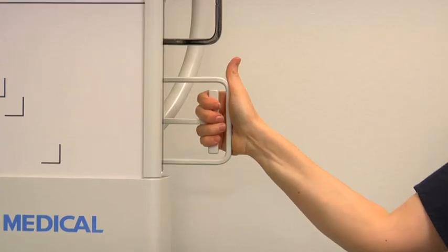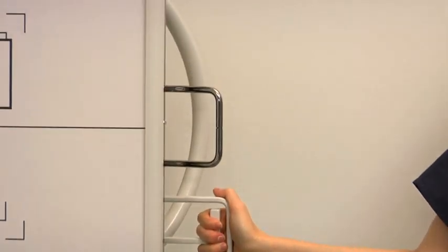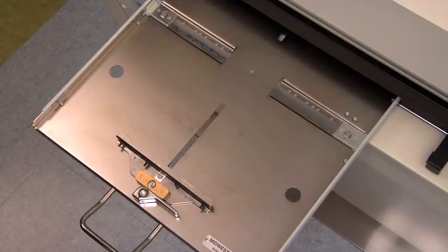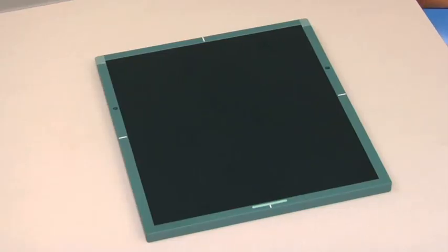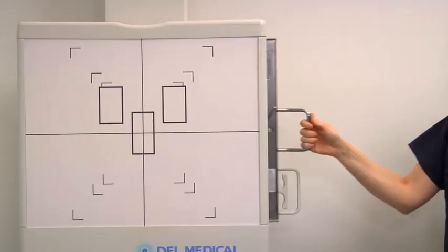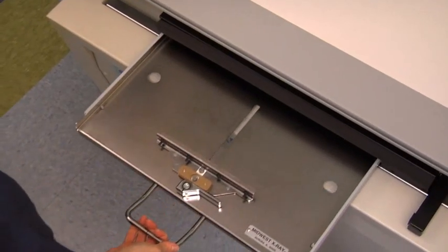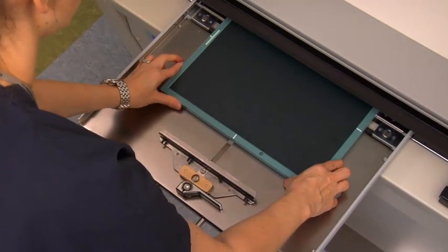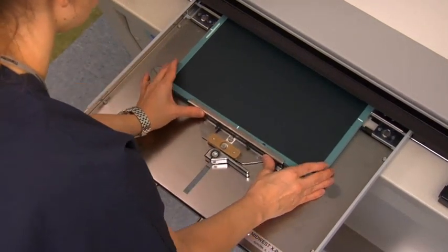The image receptor consists of an upright bucky with automatic exposure control, or AEC photocells, a radiographic table bucky, which also has AEC chambers, a cassette on the tabletop, or a portable grid with a cassette. Both upright and table buckies contain a moving grid that reduces the amount of scatter radiation reaching the cassette, and a pull-out tray into which the cassette is loaded.